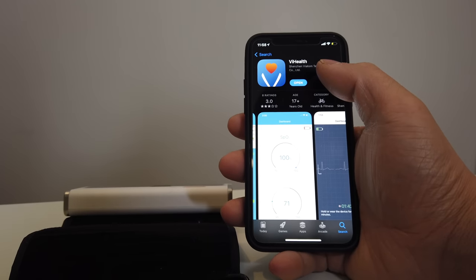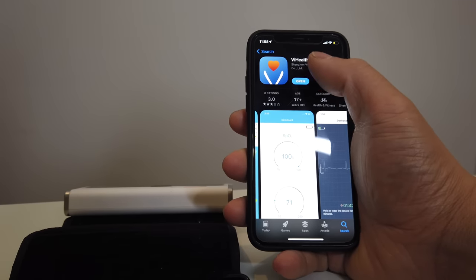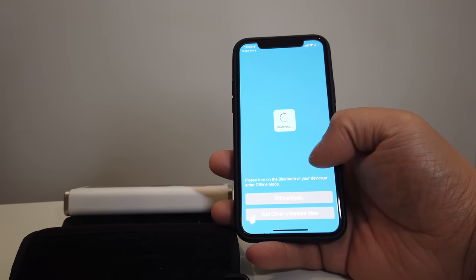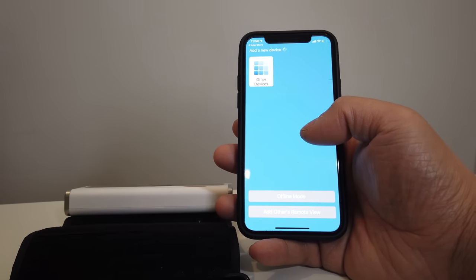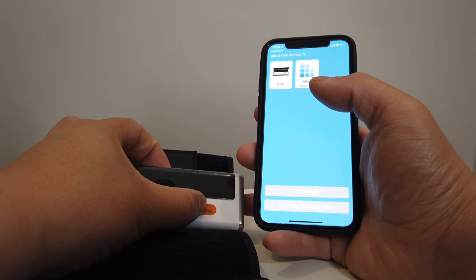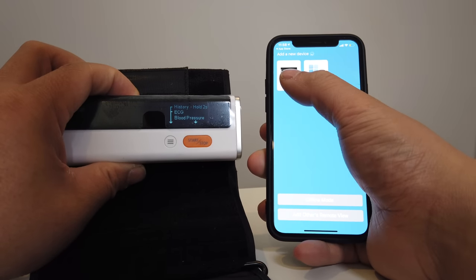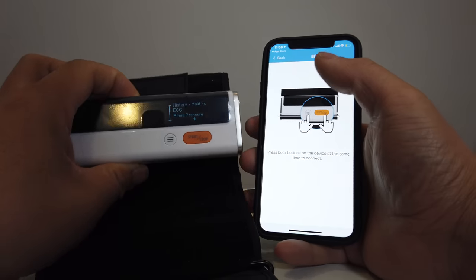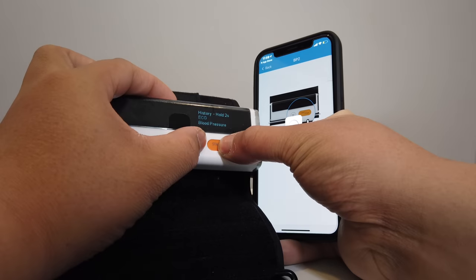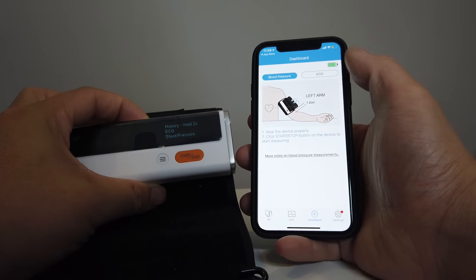In the app, you can track the ECG as well as your blood pressure. We're going to pair our device. Let's turn on the device — it's turned on now. It detects that there's a BP2. We're going to hit that and press both buttons. As you can see, it was able to detect it — very nice.